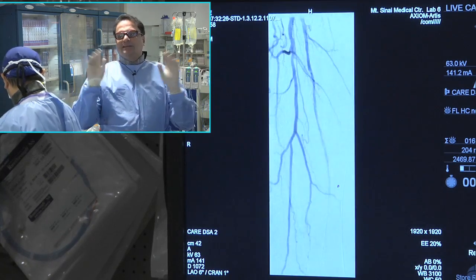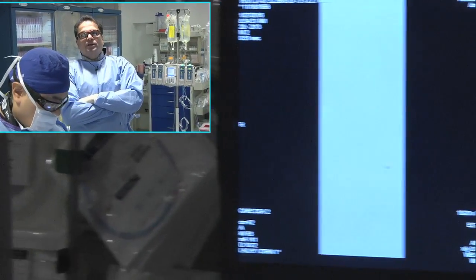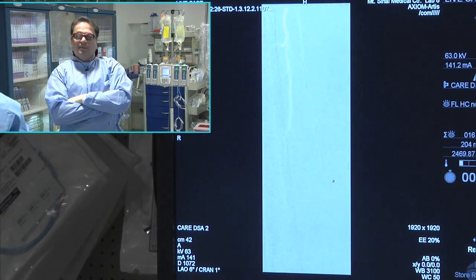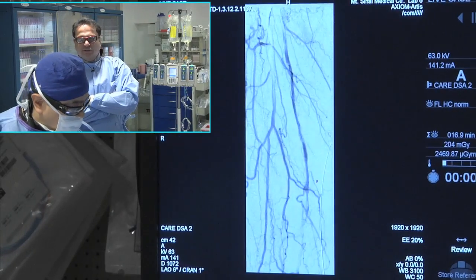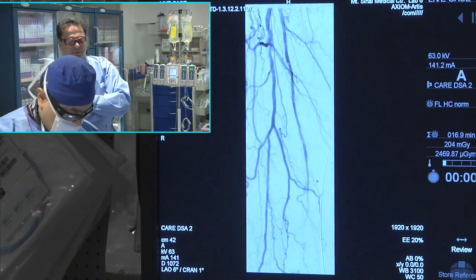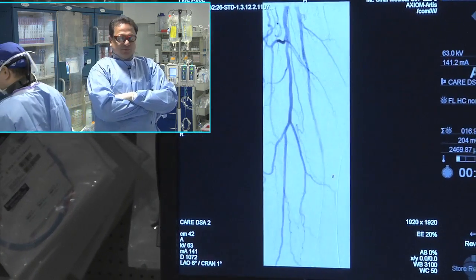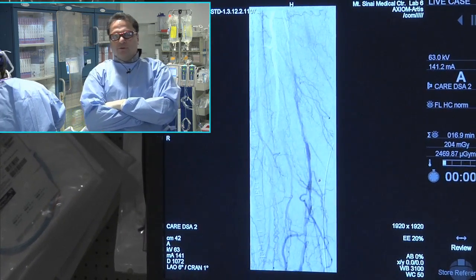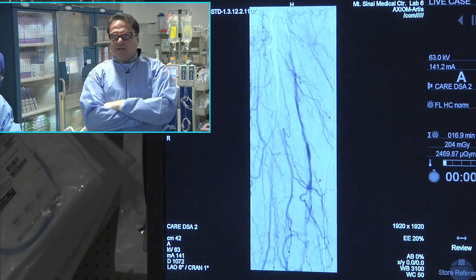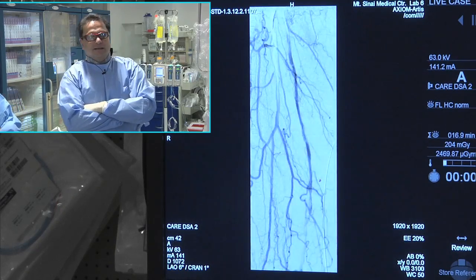So if you just take the patency data out there, and if you look at lesions that have been studied in this particular lesion length, you're probably looking at the DCB, okay, with the IMPACT data, global data, looking at lesions of 25 and greater than 25 centimeters. Remember, their provisional stent rate in that particular cohort was around 40%. And they also have presented their registry data, yet to be peer reviewed, showing that it has a very, very acceptable patency when the lesion is less than 25 and probably acceptable when it's greater than 25. So that's one. So DCB with or without stenting is an option.